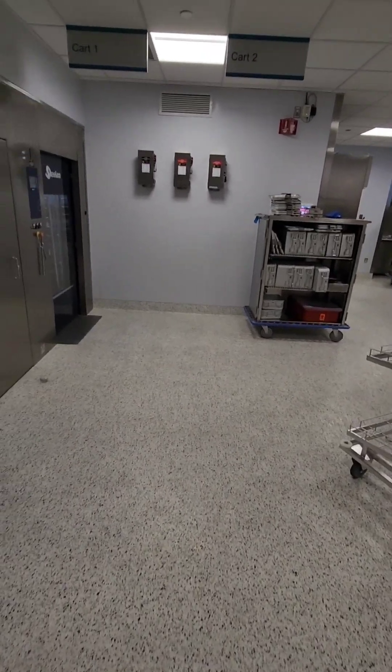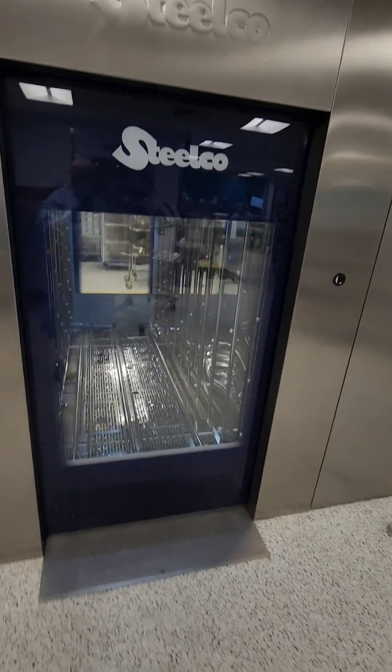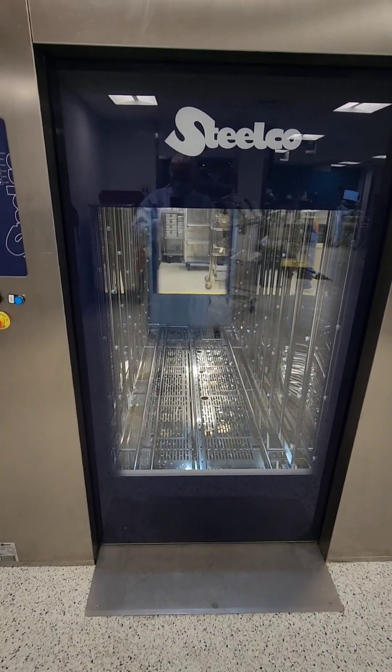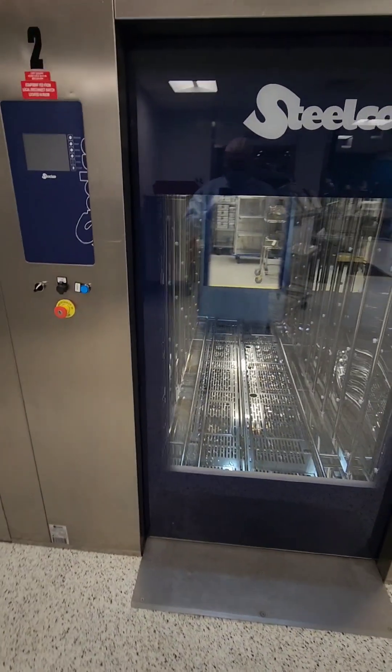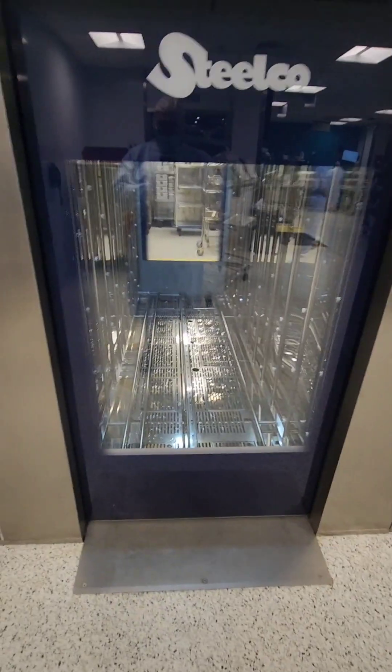Welcome back to WDYD CSP — What Do You Do as a Central Sterile Processor. Today we're starting our day off in decontamination, but before we start breaking those trays down, sorting instruments, rinsing, and placing them into our equipment, we have to make sure that our equipment is ready to go.